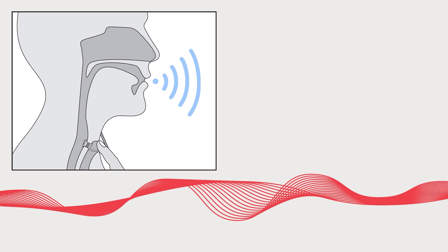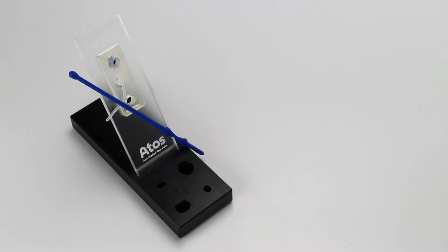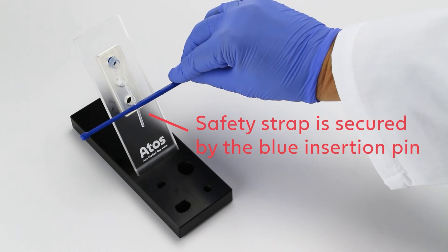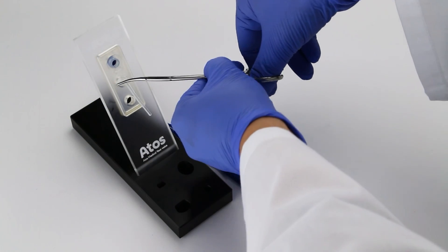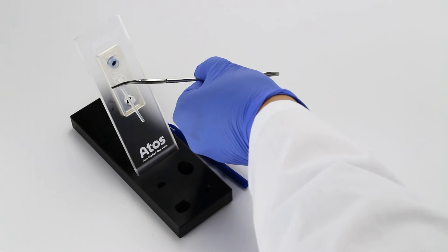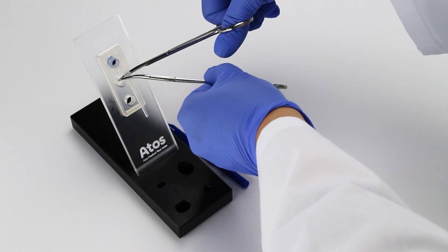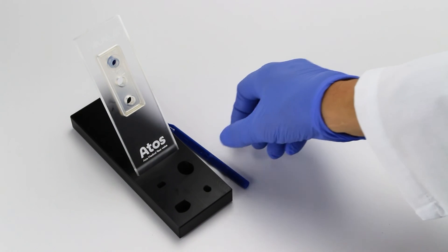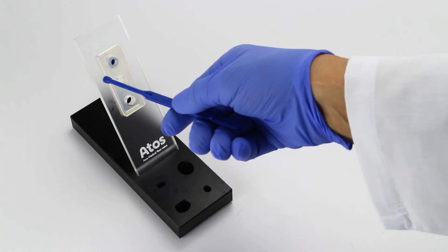Check the function of the voice prosthesis by asking the patient to speak. Once the patient is speaking fluently, ask them to drink water and observe the prosthesis to ensure no leakage is occurring. Prior to cutting the safety strap, make sure it is secured with either the blue insertion pin or a locking hemostat. Then cut off the safety strap using scissors on the outer edge of the tracheal flange. If the prosthesis spun during the cutting process, reposition the tab to the 6 o'clock position. Provox Activalve voice prosthesis is now ready for use.